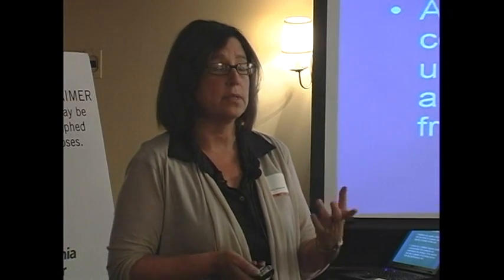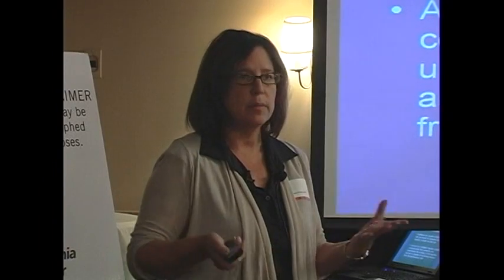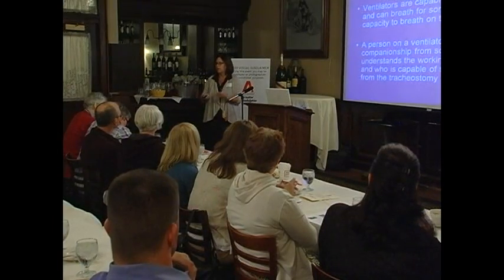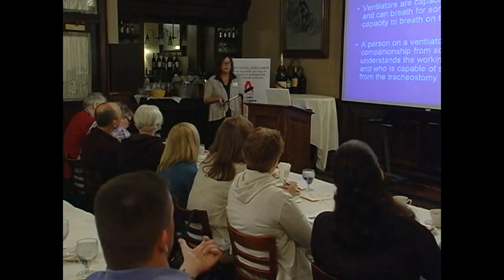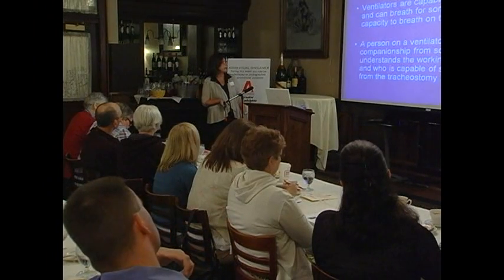And again, none of this is extremely difficult, but it requires training, it requires a learning curve, and somebody needs to be awake and available 24 hours a day, 365 days a year to monitor this. And that comes into issues of home care, which I think, again, will be addressed in other talks today.